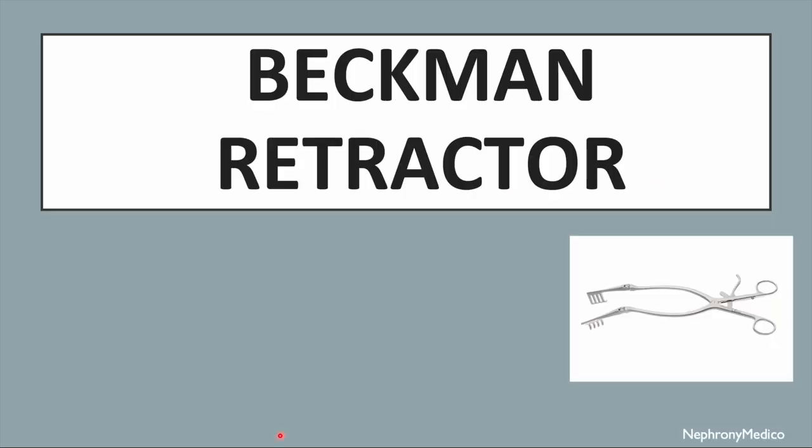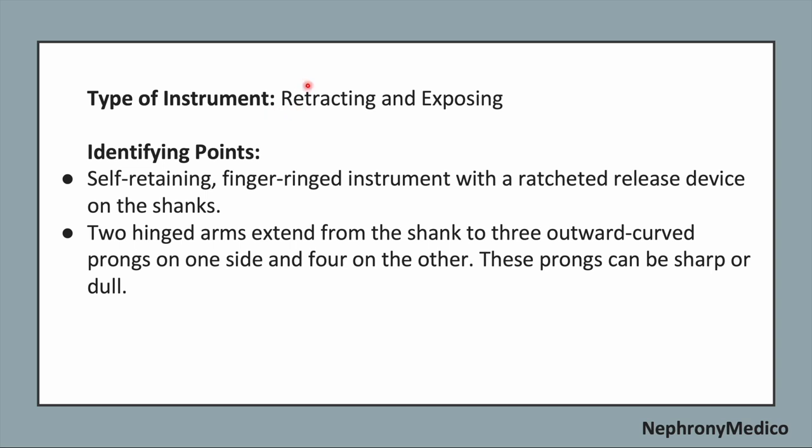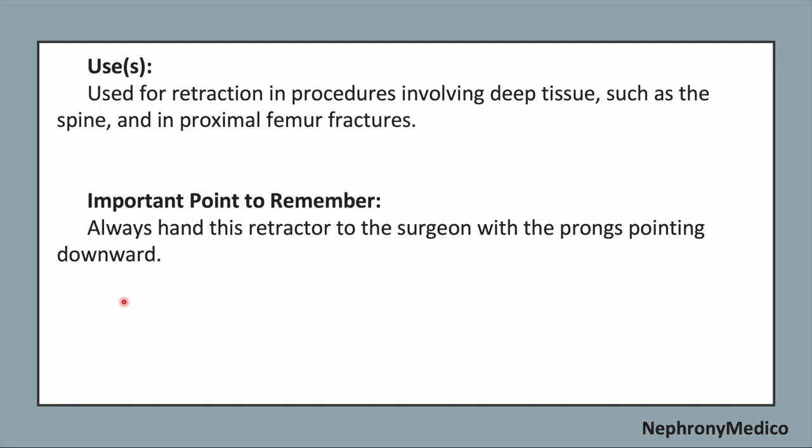Let's talk about Beckman retractor. This is a picture showing Beckman retractor. It is a retracting and exposing type of instrument. Now, identifying points. It is a self-retaining finger-ringed instrument with a ratcheted release device on the shanks. The two hinged arms extend from the shank to three outward curved prongs on one side and four on the other. These prongs can be sharp or dull.